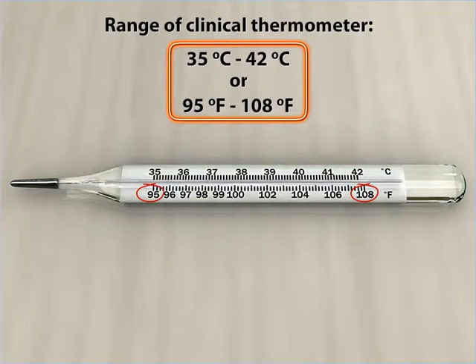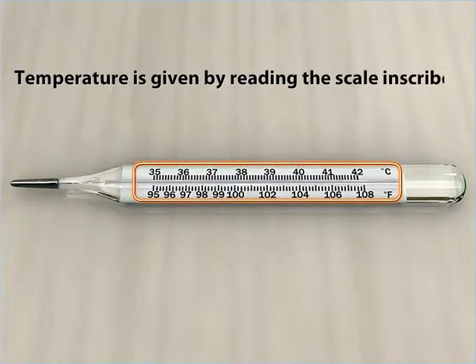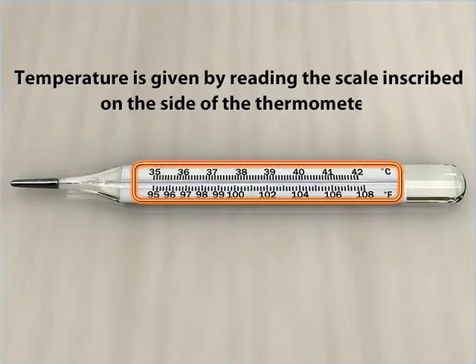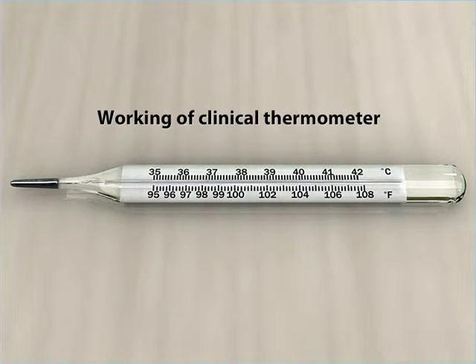That's a pretty small range. You can get the temperature by reading the scale inscribed on the side of the thermometer. Let us now see how a clinical thermometer works.